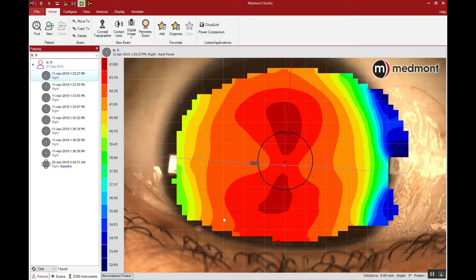This video describes the many applications of the Medmont corneal topographer in pre-fitting orthokeratology analysis. When considering orthokeratology treatment for a patient, corneal topography is an important part, and the Medmont is one of the best topographers in the world because of its corneal coverage. It gives us an incredibly large capture area and is accurate for the determination of the first lens.